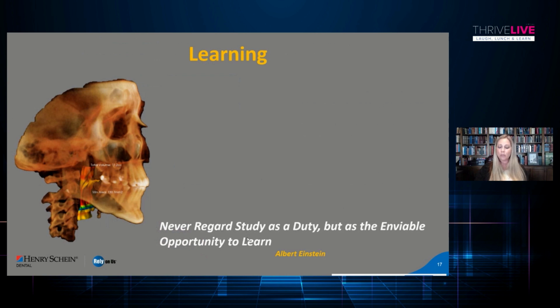So excellent for that. What I do want to really stress though, with any technology, we want to continue to learn. Cone beam CT is no different. Now, there are some courses that are provided by certain manufacturers. These courses are free because they're included in the price of your CBCT. Take advantage of that if you can.